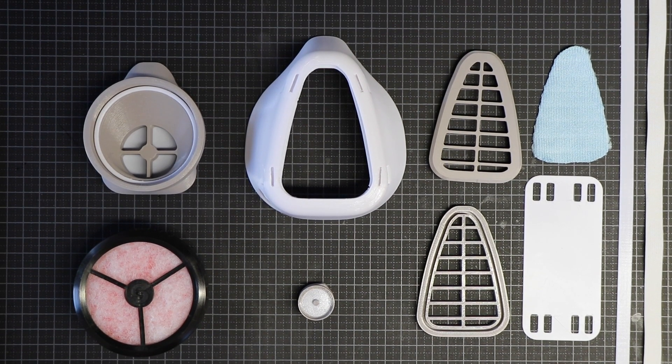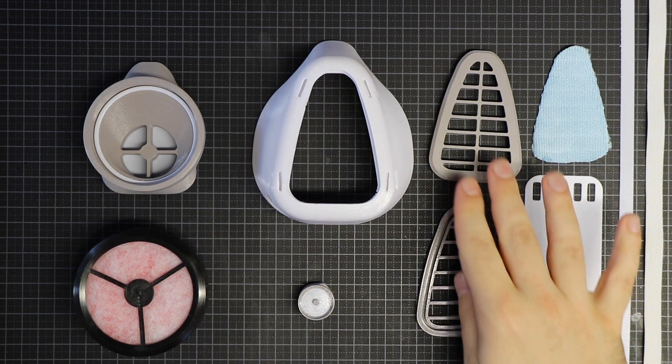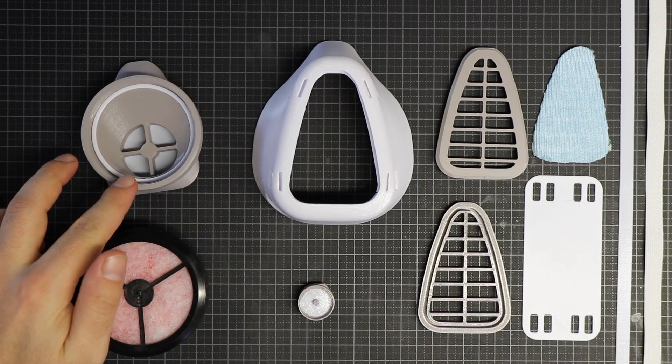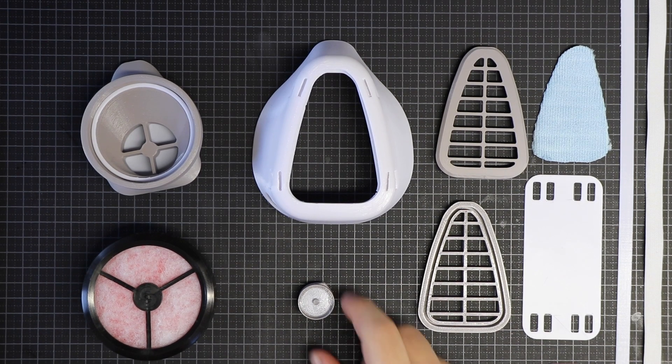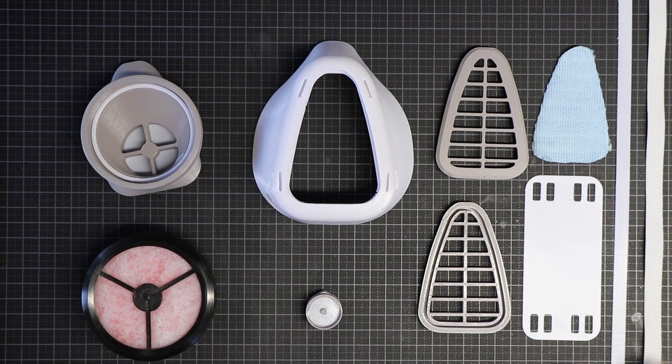These are all the parts for our respirator mask. This is the shell. These are the adapters for the microfiber cloth. This is the adapter for the commercial grade particle filter. And this is the vent for exhaled air. And these are the straps — there is a 3D printed option or a store-bought rubber one if you prefer. And these are the fasteners for that.